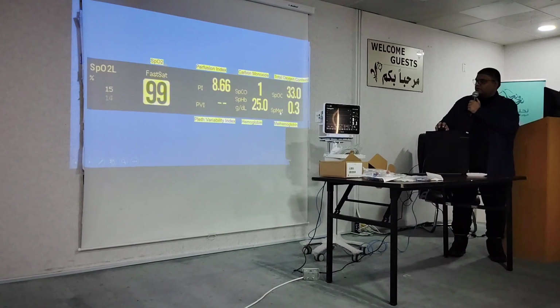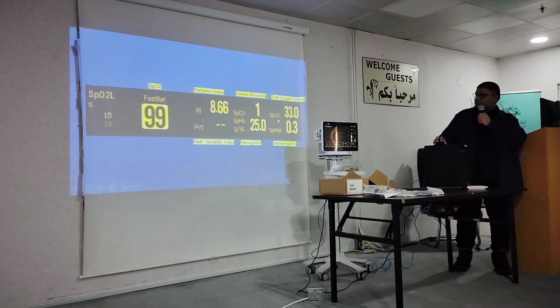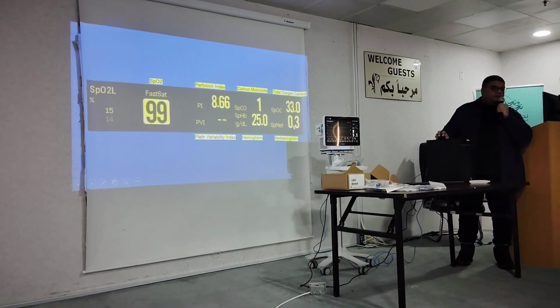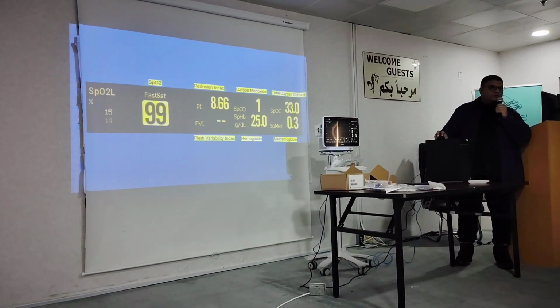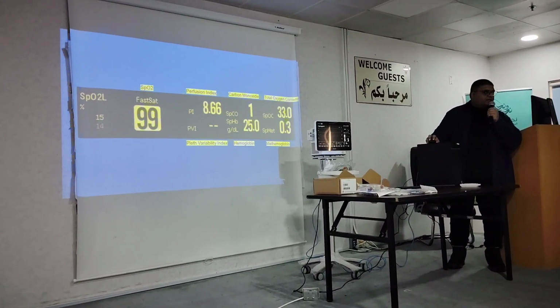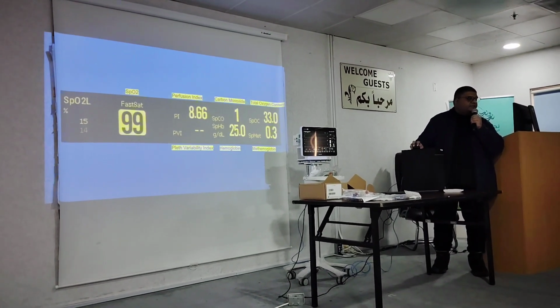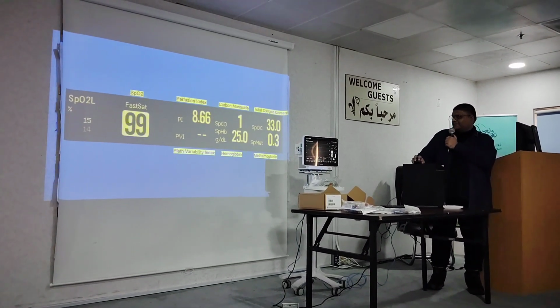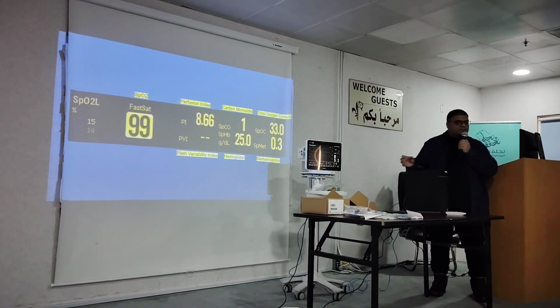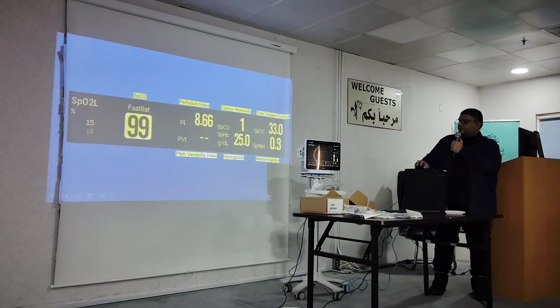Also, I will talk about SpMet at the same time because it is related. If you have methemoglobinemia, maybe your hemoglobin is altered because of some drug interaction. Maybe you used too much lidocaine on a patient, or you injected lidocaine intravenously. So yes, you will have methemoglobinemia. It can also happen due to other reasons that we still don't know. If you have that, you can detect it.